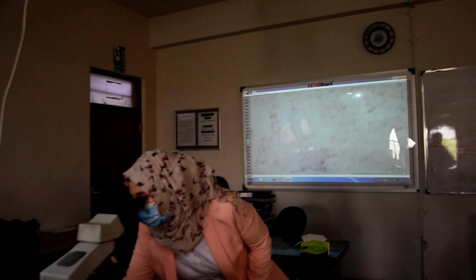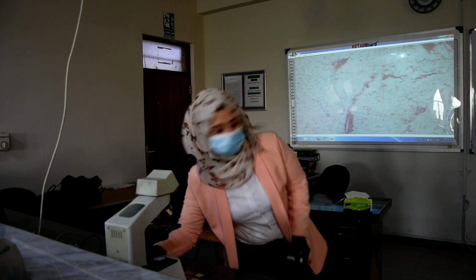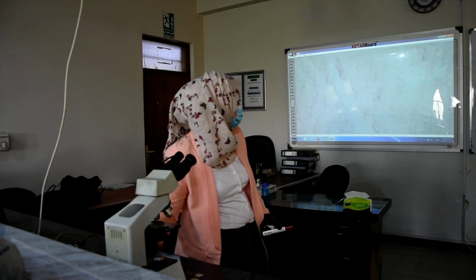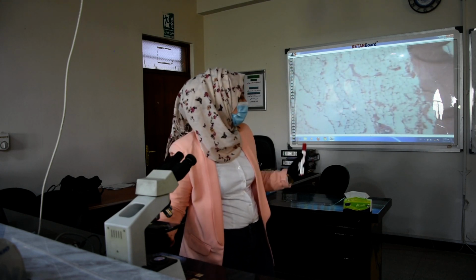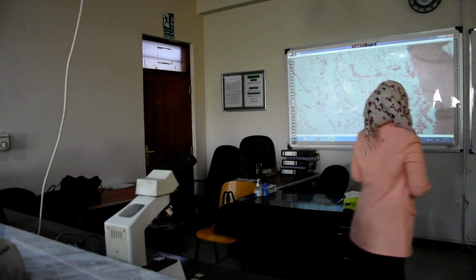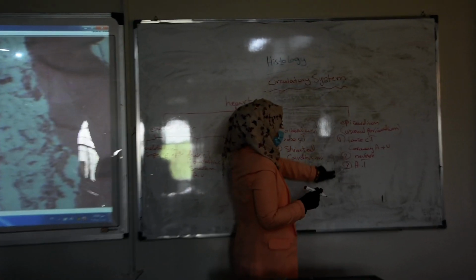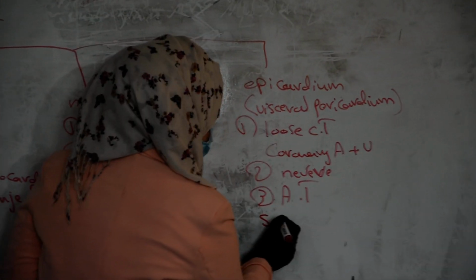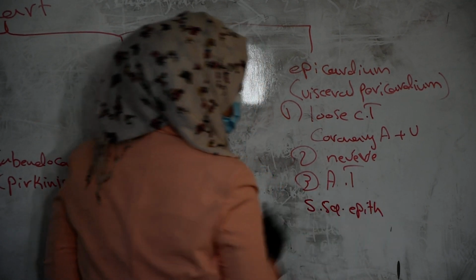Okay. I forgot to explain that the epicardium from the outside is lined also by simple squamous epithelium.